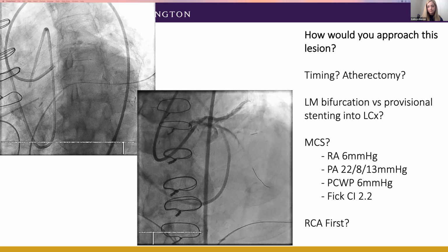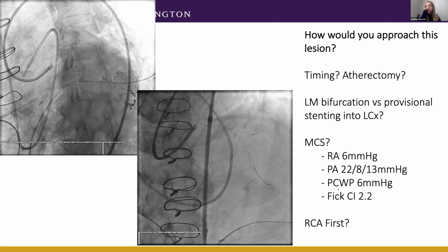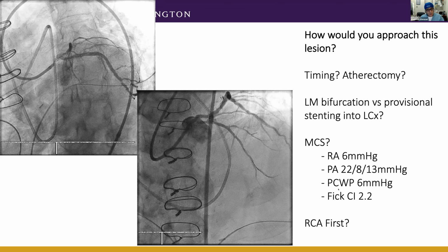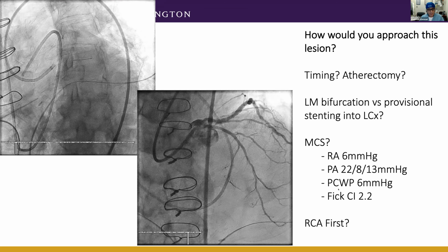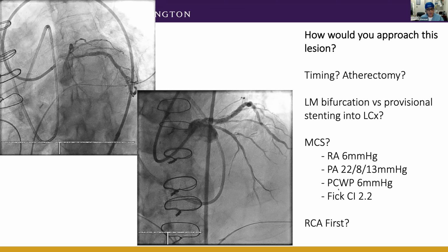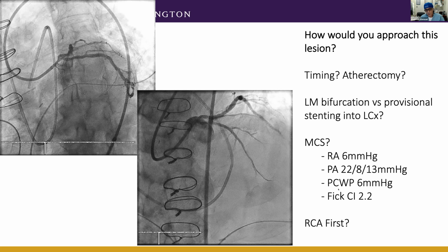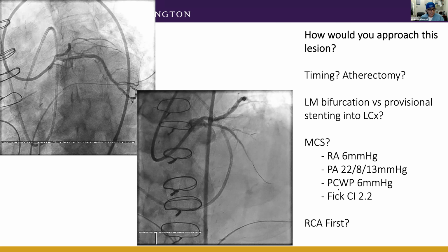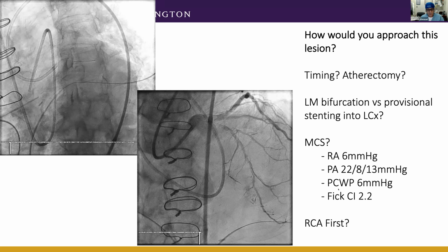So the question now, I would start from the guide, right? You are doing bifurcation, left main in a calcified vessel, right? And I see you guys put in a right heart catheter, probably, and the chest tube is obvious there. You want to know if there is hypovolemia. So this is all good. So I will start from the sheath choice to the guide choice and access choice in a complex situation like this.